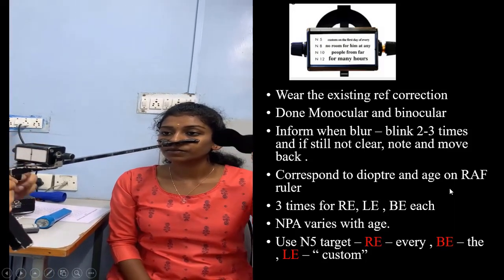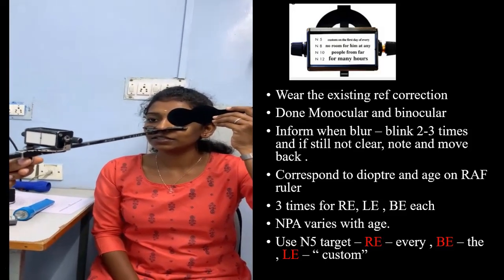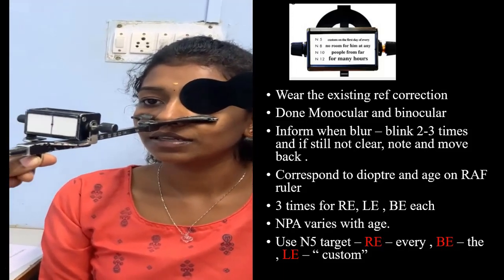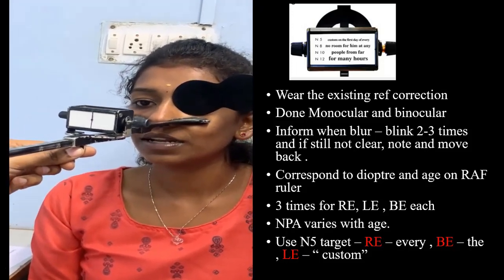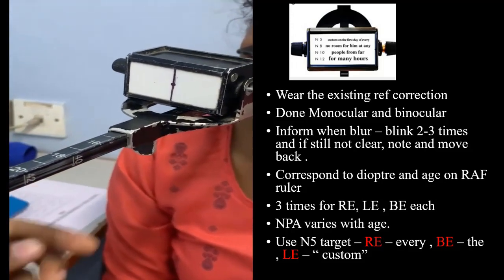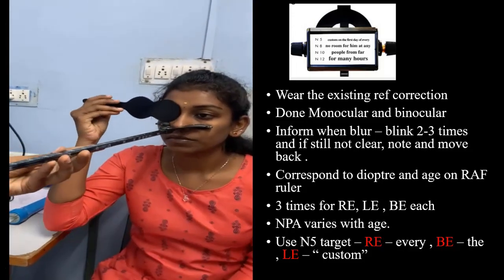Similarly, the patient has to wear their existing refractive correction. First, it is done monocularly, then binocularly. The target drum can be moved forward 1 centimeter per second, and whenever they notice blur, the value has to be noted. It has to be repeated 3 times. NPA varies with age, and it has to be correlated according to their dioptric correction and the age also.